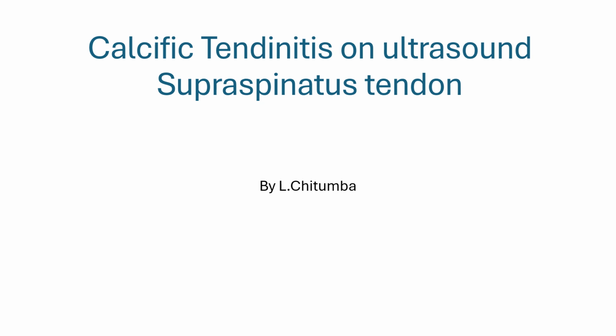Hello and welcome. In this presentation, I'm going to discuss what is called calcific tendinitis. I have a case of calcific tendinitis affecting the supraspinatus tendon.